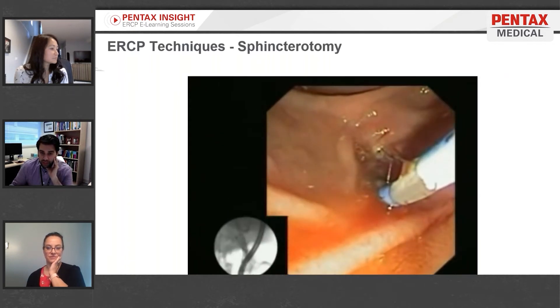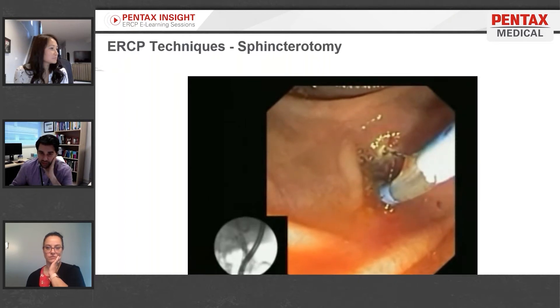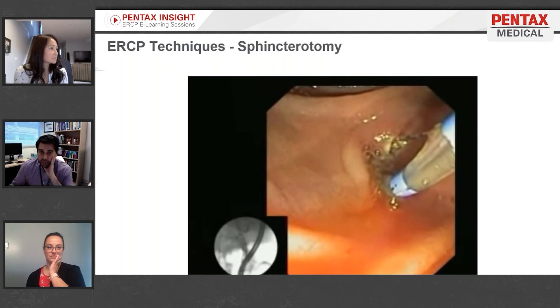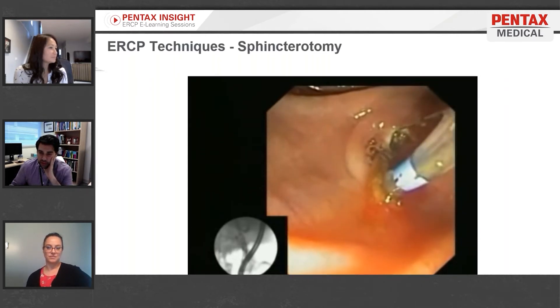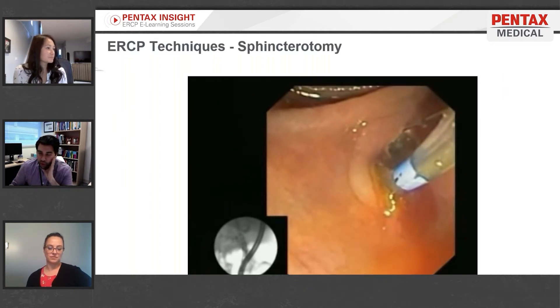Here's a still image of an example of the fluoroscopic view you might see. The duct has a bunch of white areas — what we call filling defects — and those are all stones. This is a patient who came in with abdominal pain and stones seen on ultrasound. Now what's being done is what's called a sphincterotomy, or papillotomy.